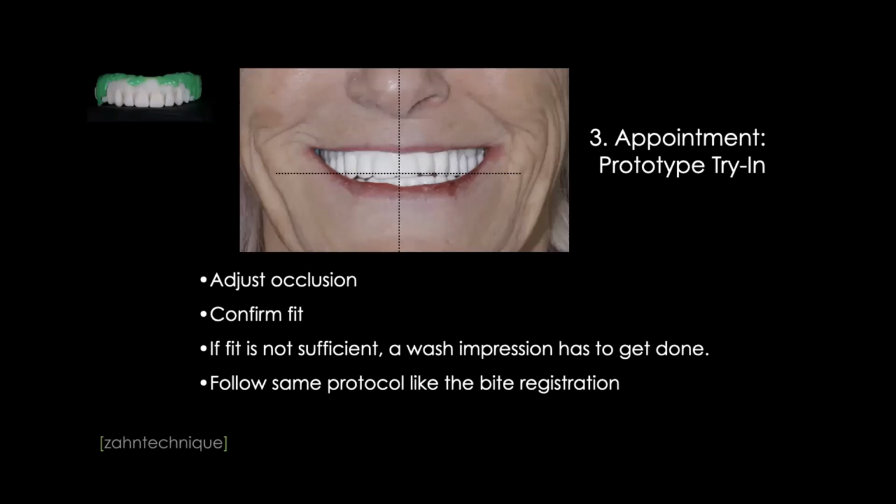We talked this morning in a team, and one of our team members said, well, you're pipping it, right? And it's like, what is pipping? And then, oh, PIP paste, right? Yeah. Remember in module 1 and 2, Dr. Roy in his video showed how you use PIP paste to remove any excess contacts and so on, so that everything sits nicely. It's very, very important.